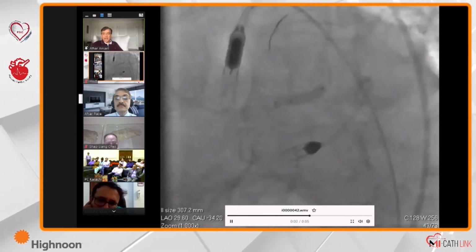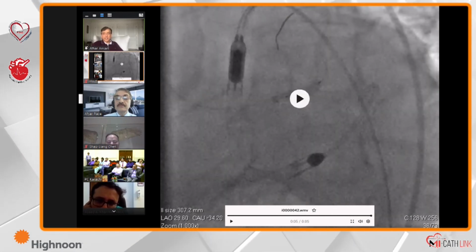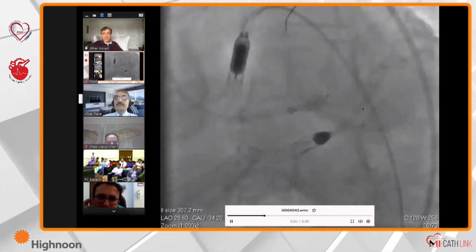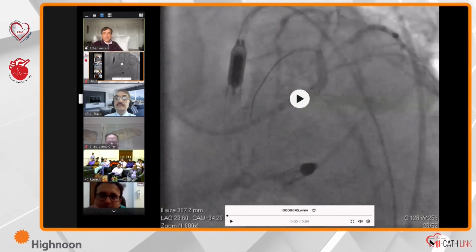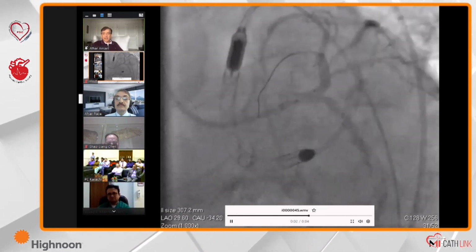So the patient had, on echo prior to the procedure, an ejection fraction of 10% with a 4+ MR. So it was all ischemic MR, and he collapsed because of global severe ischemia. So you can see, very quickly acting could save a life.